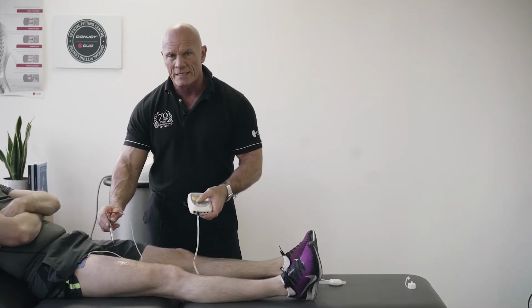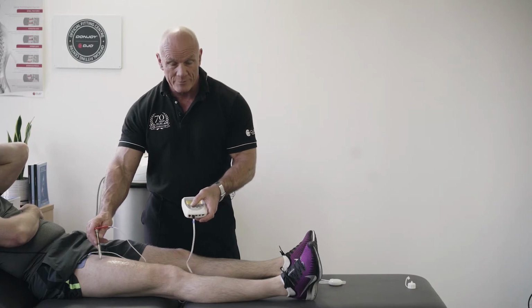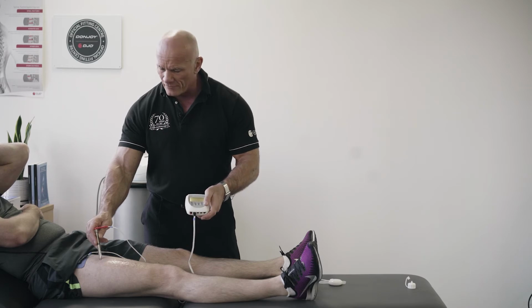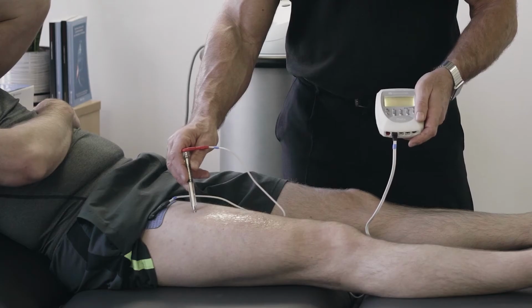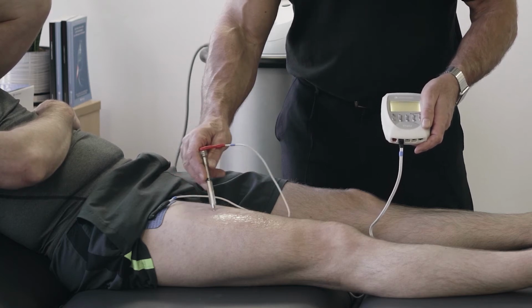You only need a small amount of intensity, guys. I set it at sort of level 5. This is not in milliamps. And you'll find that with some patients 5 might not be enough. With other patients it might be too much. So it's a good place to start. So I set it at 5 and my patient can now feel a tingling sensation in the muscle, but we're not seeing any evidence of an action potential.